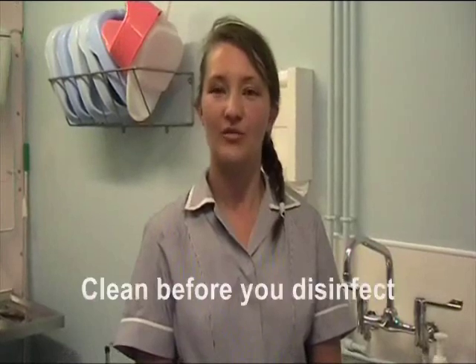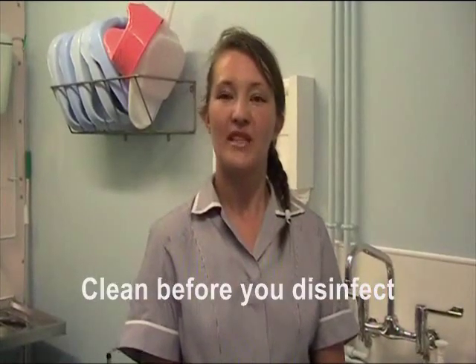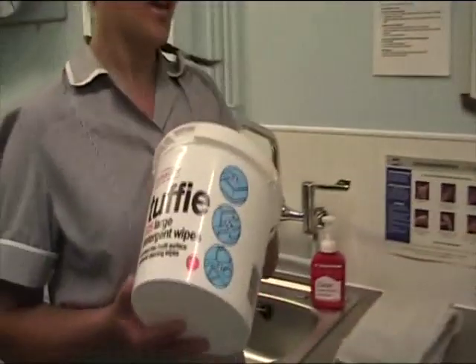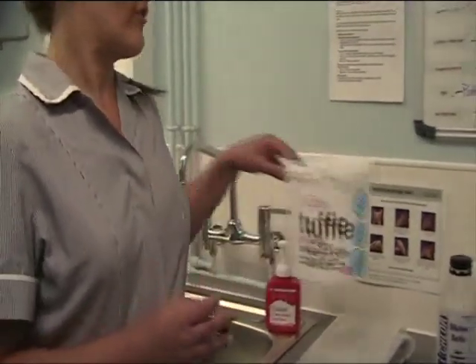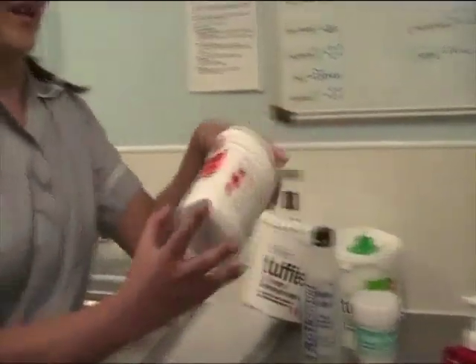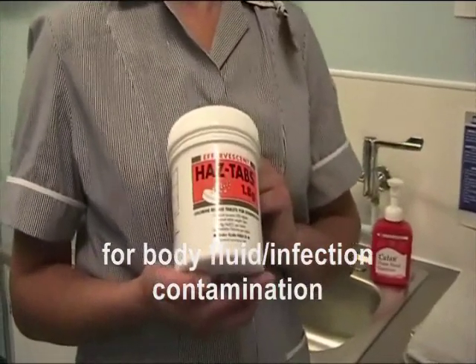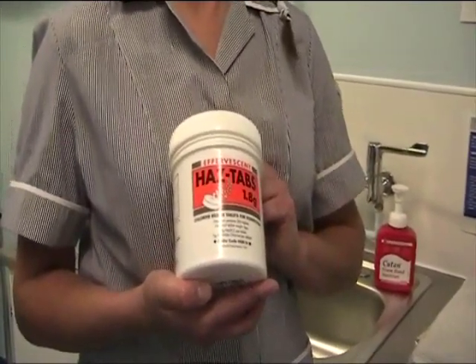In order to do this, you need to ensure that you have the correct personal protective equipment and the correct cleaning and disinfection products. There are a number of options available. The most important principle is that you clean before you disinfect. You can do this using a detergent wipe, such as Tuffy, followed by a chlorine-releasing solution at 1000 parts per million. This will ensure that any contamination with blood or body fluids or any other infection is eliminated.